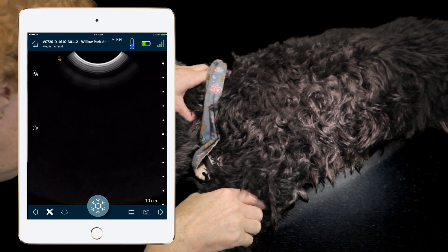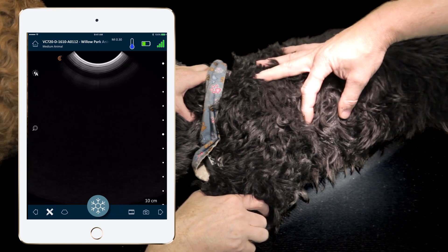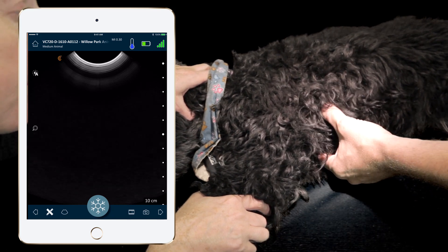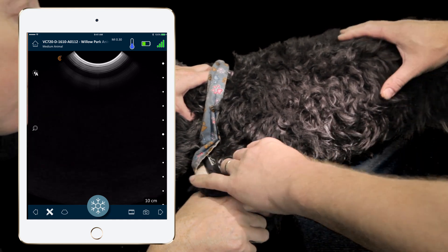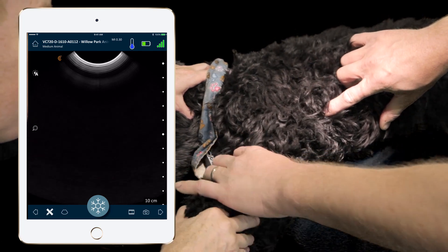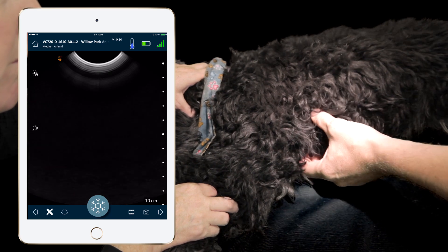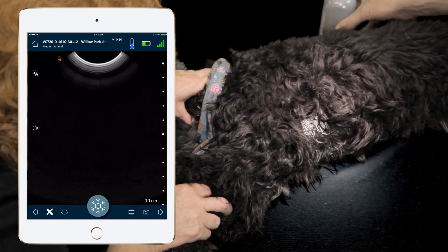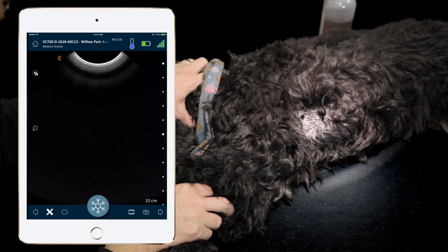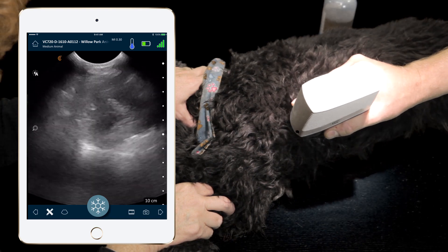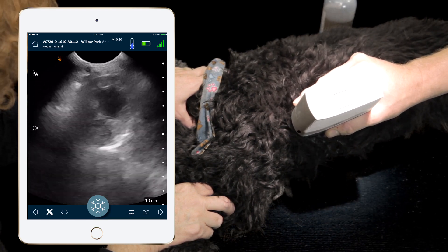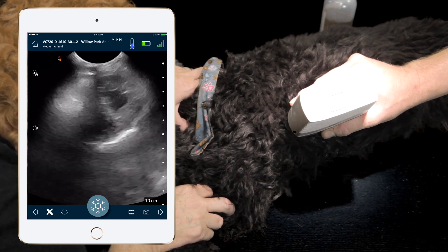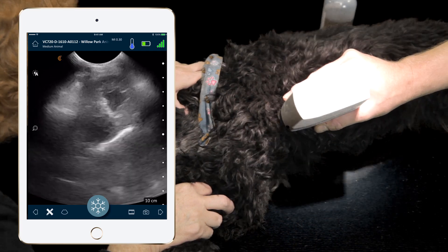The next site in the FAST thoracic exam is the pericardial site, at the 4th to 6th intercostal space over the heart. You can palpate for the most intense cardiac beat, bring the elbow back to locate the probe site, or auscult for the loudest heartbeat. Once we have our landmarks, we apply alcohol, separate the fur, and place our probe at that 4th to 6th intercostal space, moving it until we find the heart. In this left parasternal view, we are primarily ruling out pleural fluid or pericardial effusion rather than assessing cardiac detail.